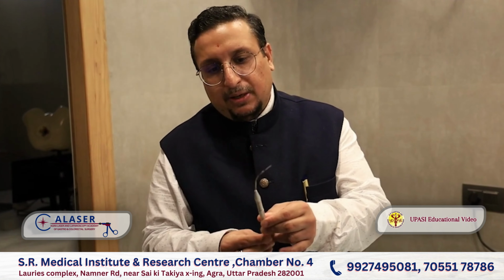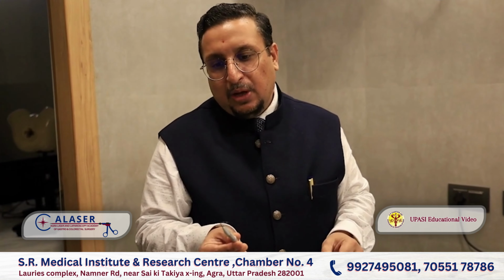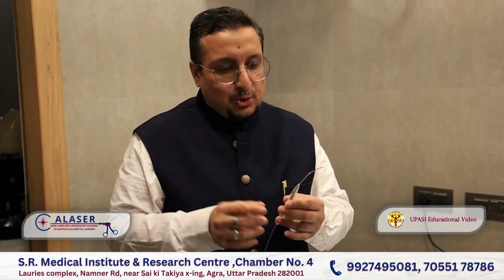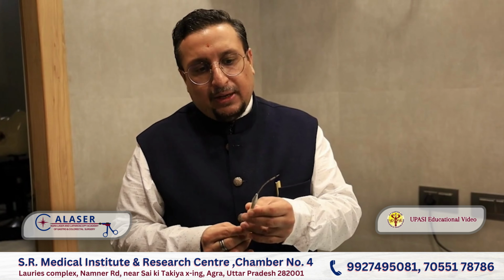What happens if you keep it more outside and you are in the tissue? Sometimes due to heat and trauma, it breaks. And if it breaks inside the tissue, that would be a mess for you, right? I have experienced this in one of my cases, and that was a horrible experience. The tips got stuck in the tissue and you cannot find them, right? So that is why I advocate 1 to 2 millimeter only. The chances of breaking are very less.